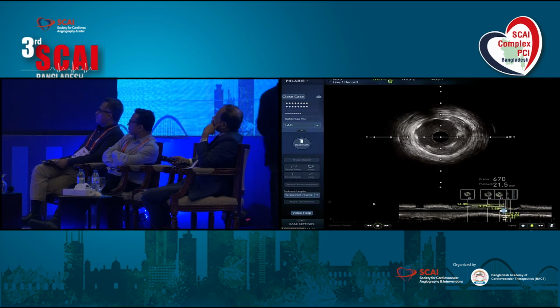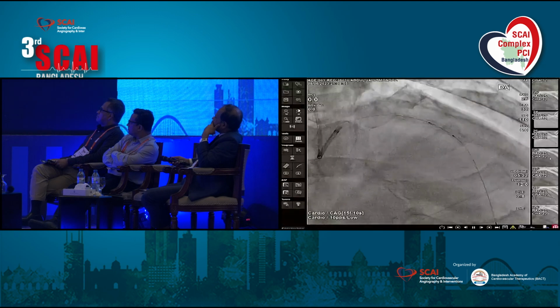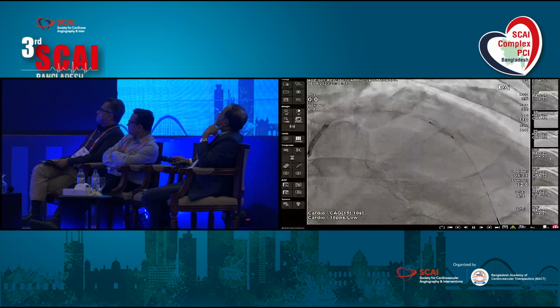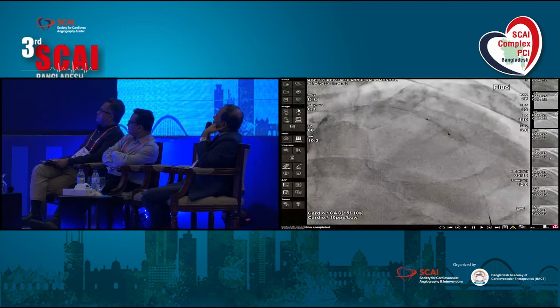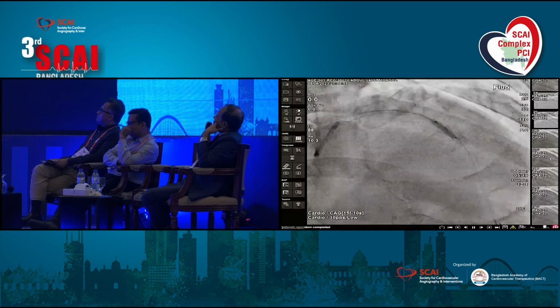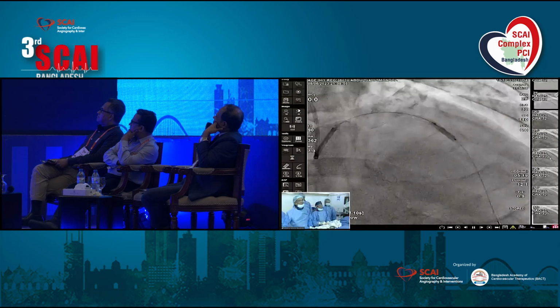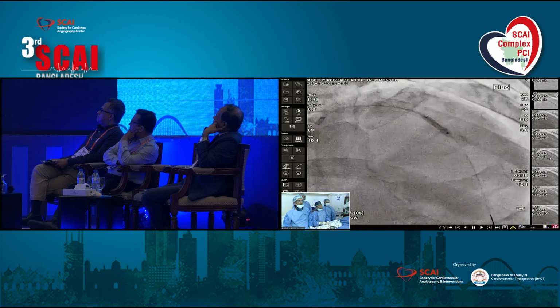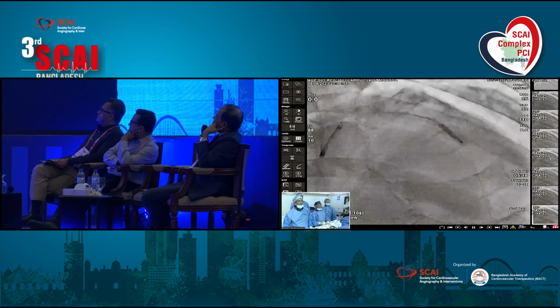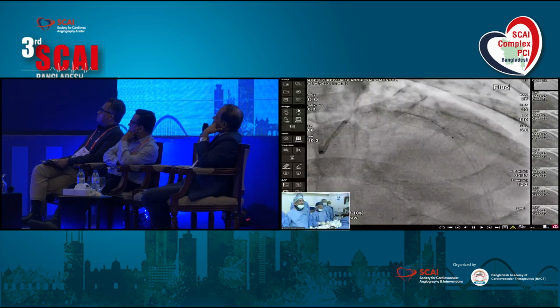You can remain inside, in a little bit, sir. Pull back. No, in a little bit. More distal, more distal. Right there. Yeah, go up. So this is 3.0 balloon? Yes, 3.5. So distally you are going with 3.5. Yes, this is the 3.5 balloon inflation. 10. We're going to 10. Deflate. Okay, go up. Okay.